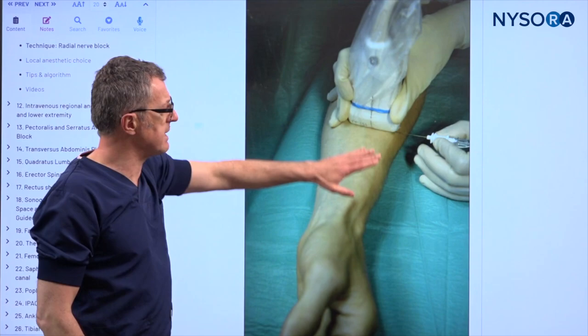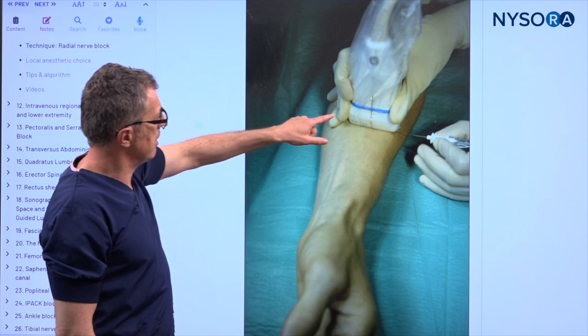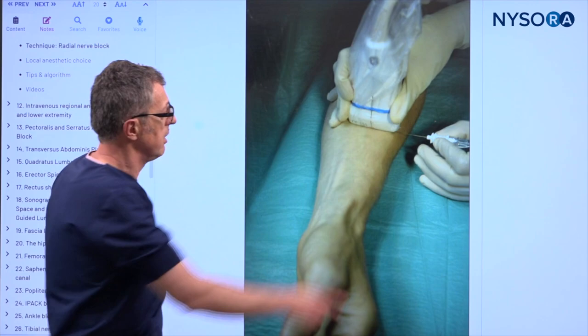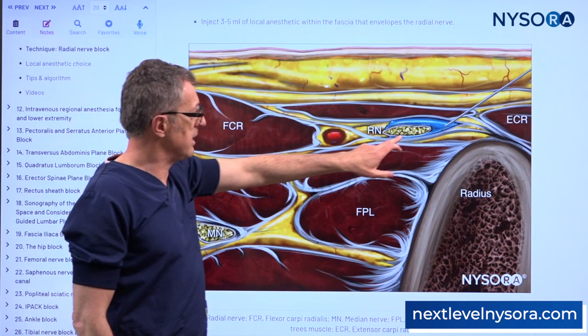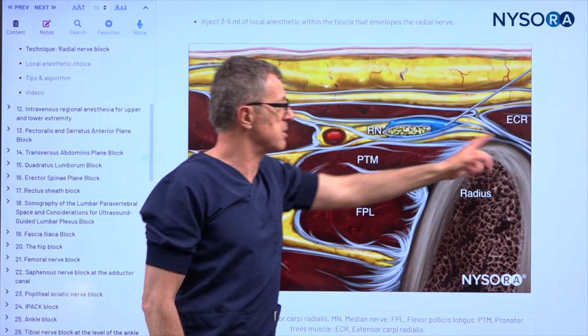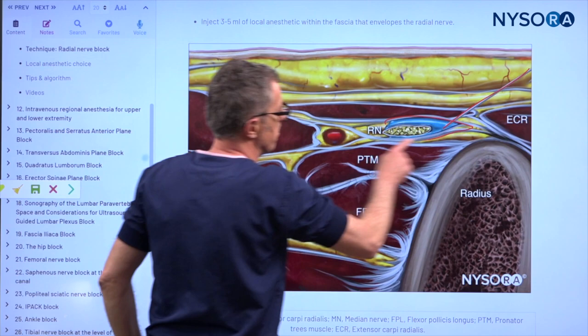Let's do the block. Here we opted to do an in-plane technique. This is the thumb — the pollex — and the ultrasound transducer. The block can be done anywhere alongside this path. This is an in-plane insertion of the needle. The reverse ultrasound anatomy demonstrates what we're trying to do: that's the radial artery, the superficial radial nerve inside the fascia sheet, and the radius as a bone. All we want to do is place that needle into the fascial plane.